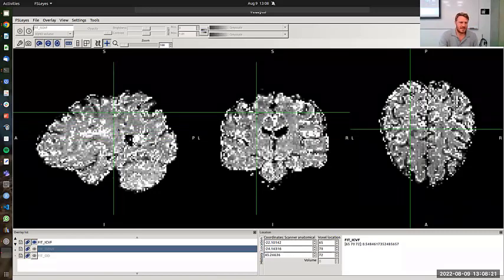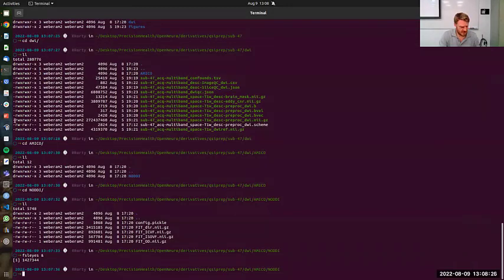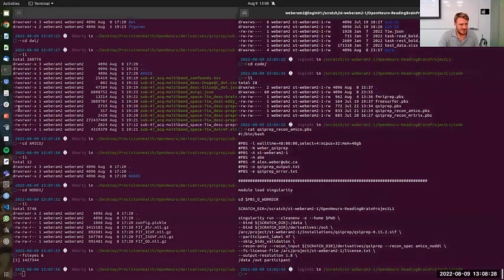This actually looks really dirty. Okay. Because it shows the importance of Singularity in these complex toolkits.